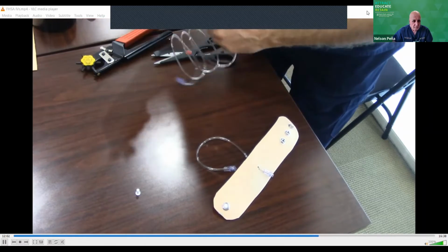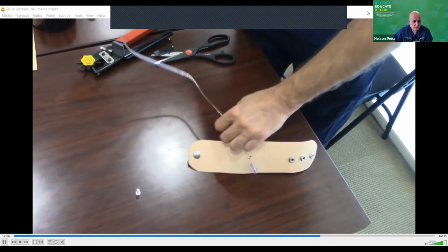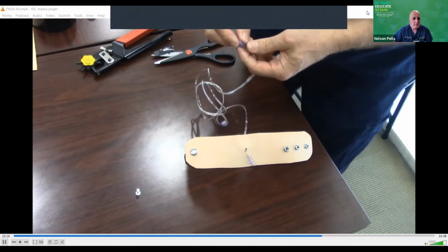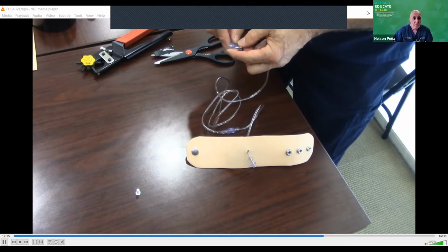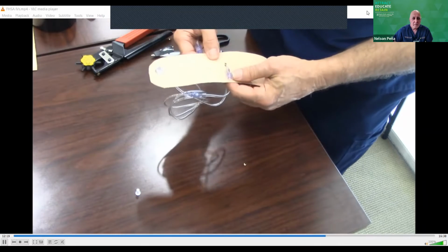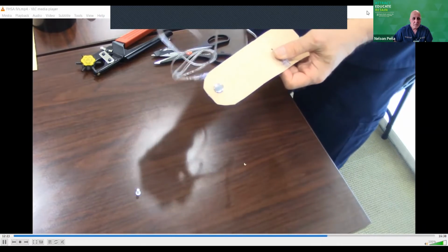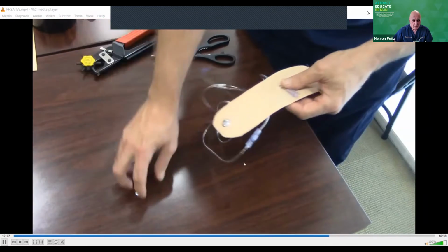So I would connect this here, and then you run this down to a, and I'm going to show you how to build a little connection for this end so you can actually connect it to a suction container. So all the fluids and all the medications and everything you put through this IV end up in the suction container and all over the floor.